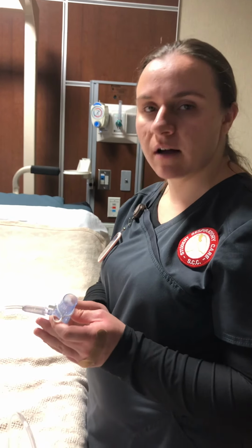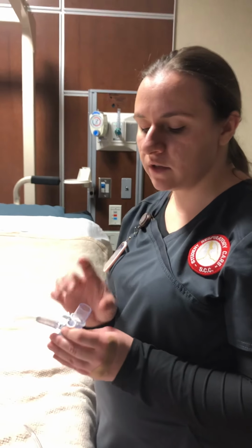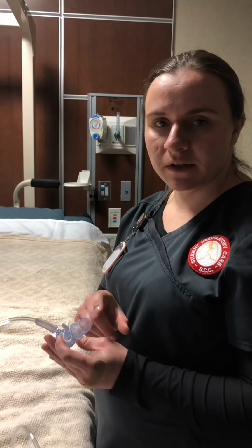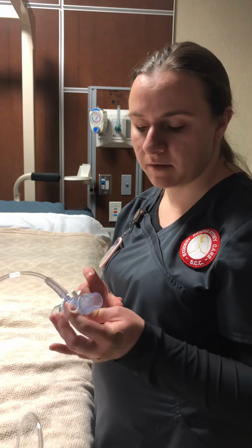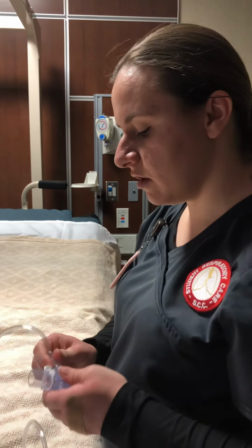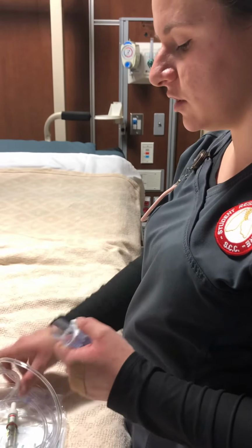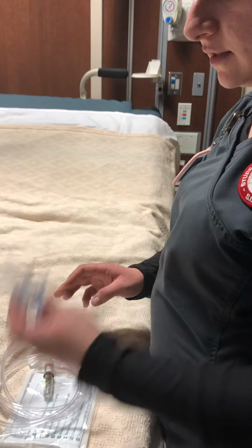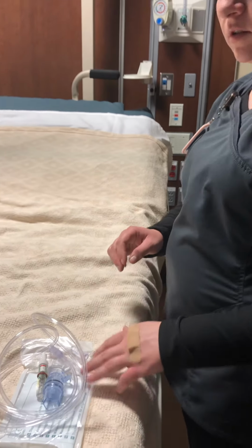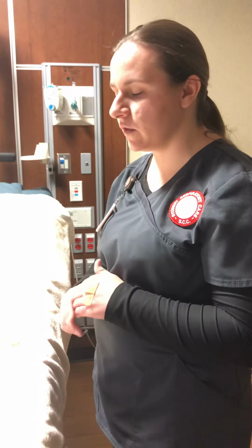Now with the EZ PAP, this can also coincide with your nebulizer treatments. So you can have a T-piece on here, and you can have a medicine cup, and they can take their nebulizer treatment through an EZ PAP. So when I'm finished, I would always shut off the oxygen, and then I would remove the oxygen tubing, set it in the appropriate place, and set this in a safe place so that way we can do a treatment here later on. So we'll do a treatment every hour with them.